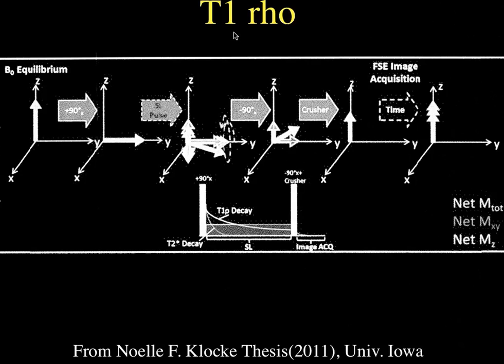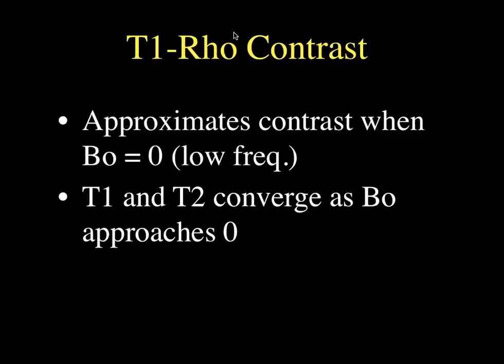Okay. And again, these images are kind of more like color maps, right? Yes, right. They're usually presented in color maps because it's a little bit more obvious. It's just a little sexier when you do that. I don't think we need to go into this.